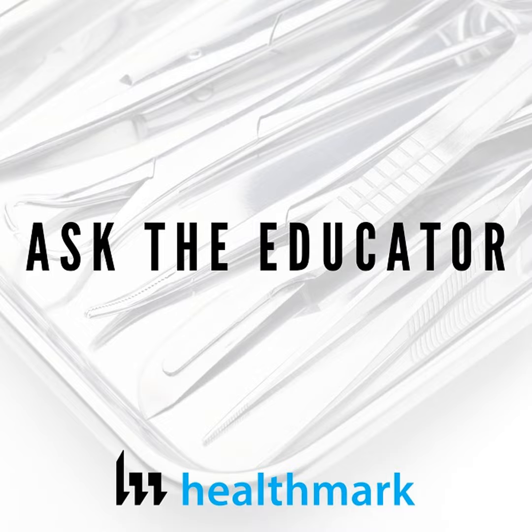Another thing is, if you are in the IFUs, you'll notice that some manufacturers recommend that borescope inspection take place in decontam, which makes a lot of sense. But a lot of times when people purchase borescopes, they put them in the assembly area, which is also fine, but realize that some IFUs recommend this step take place in decontam, and some, I believe, recommend the assembly area. Both make sense. There's a quality check that can be done before you assemble for sterilization, and that's good. But even better would be to check it before it gets to that side, and be able to see your work and check whether your brushing practice is actually effective, right? And before it gets into the hands of somebody on the clean side with no PPE on. So there's a lot of things that go into it, I believe.